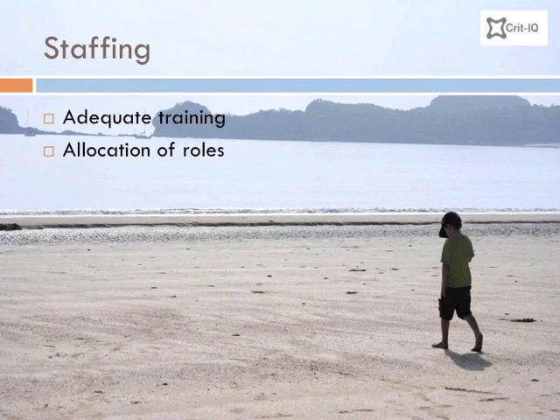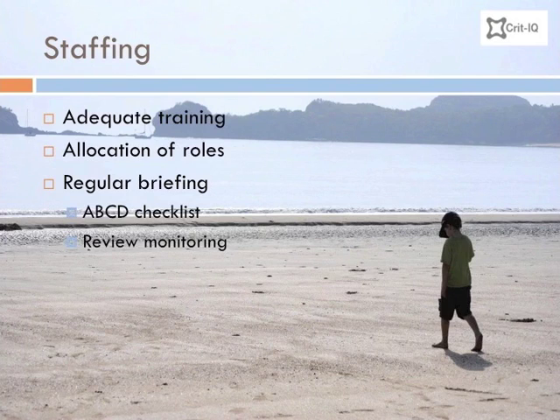A great practice to adopt is to brief for your trip with your team before you go. Go through the preparations in A, B, C, D order, checking the monitoring, last look examination findings, and outline your plans for any potential adverse events. You should repeat this every time you move the patient, at key times, such as before departure, and at regular intervals.